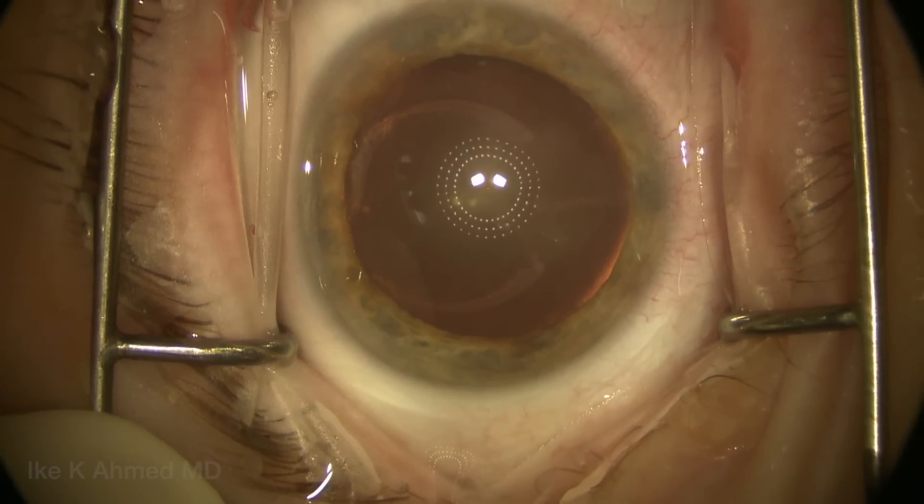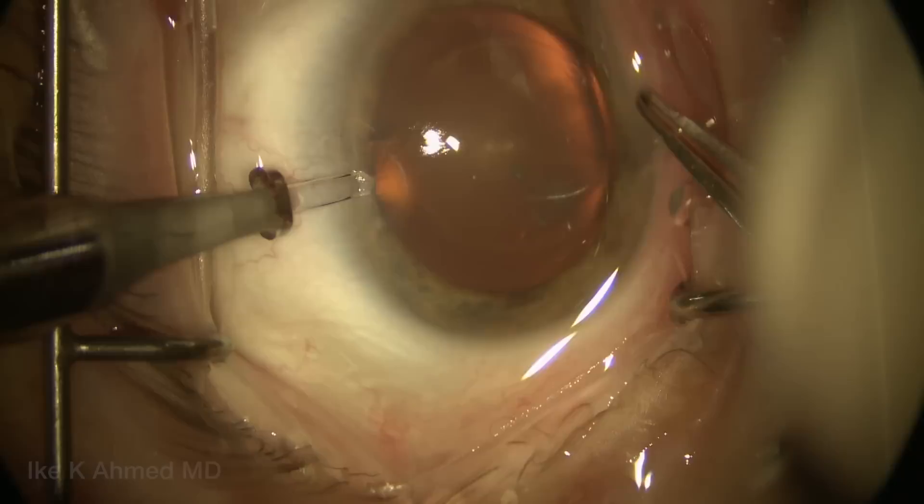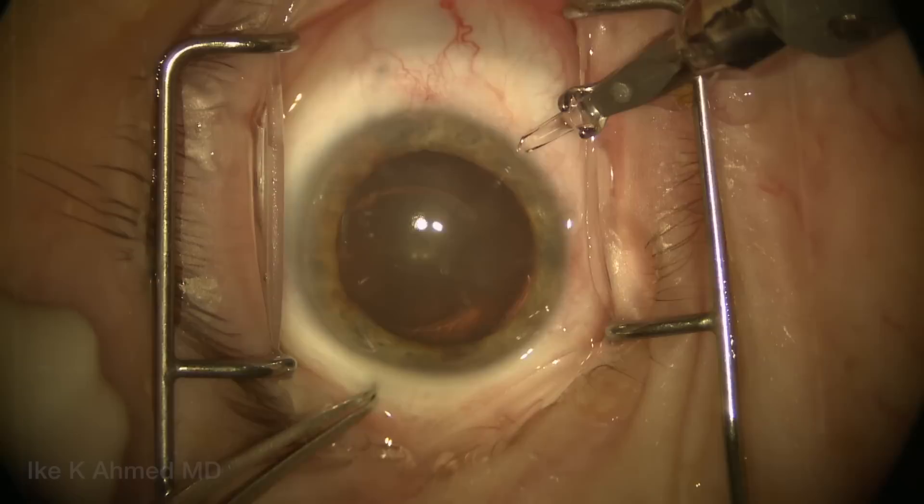This patient has had a traumatic subluxed cataract with an atonic dilated pupil. We'll first start by making three incisions. Notice where these incisions are placed — there are three incisions we'll be using primarily for the iris repair, and they're equidistant apart: left, right, and then nasally for access.